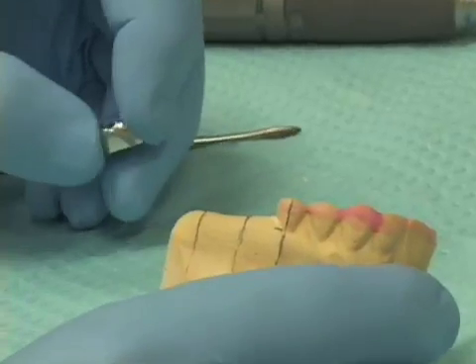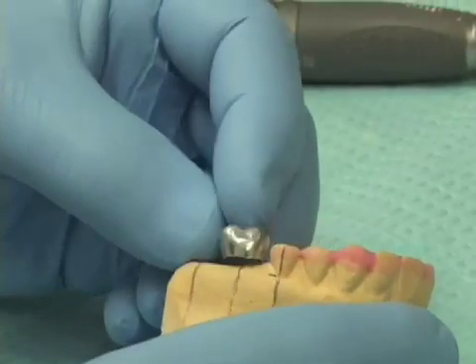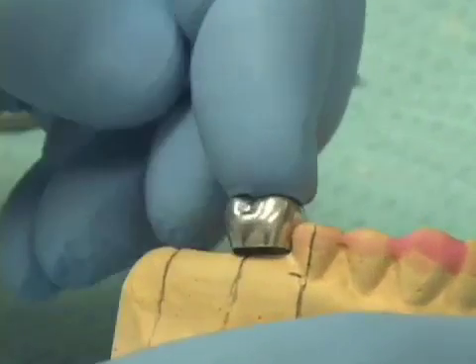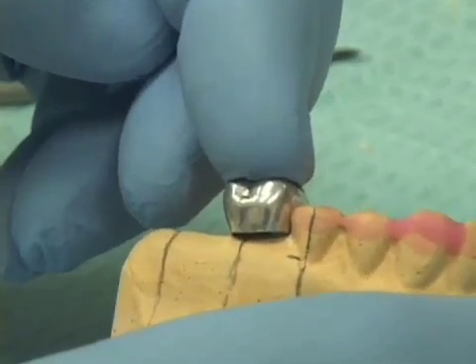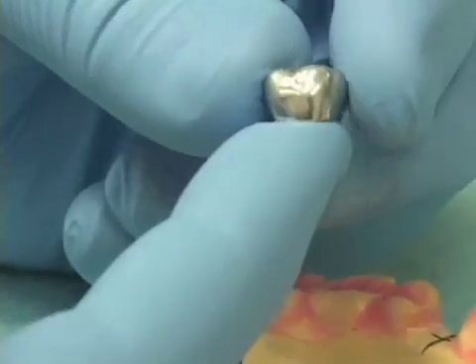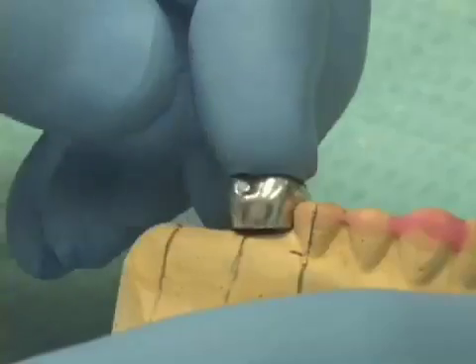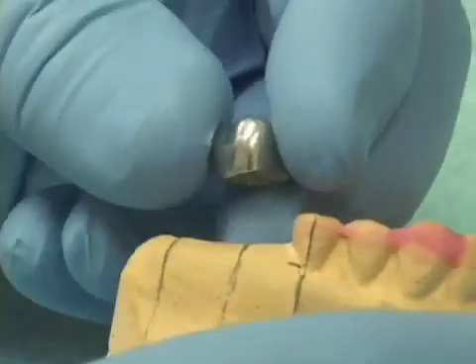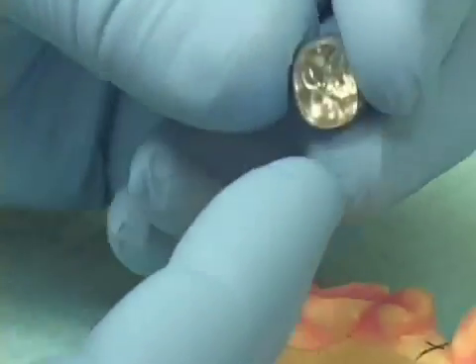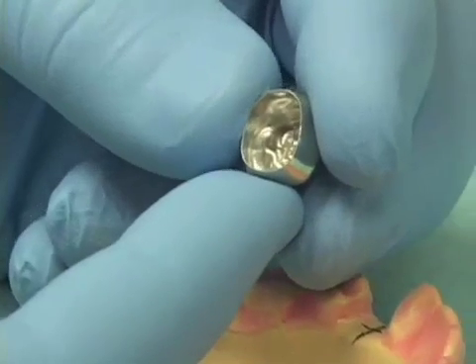When it comes to the areas of the molars, we can take an aluminum shell crown form. They don't have the polycarbonate crown forms for molars, but if we take an aluminum shell crown form for a molar, it can also be re-contoured at the cervical to see that it's just about the right shape. One of the things that's very convenient with the aluminum shell crown forms is to simply fill the aluminum shell crown form with self-curing acrylic.